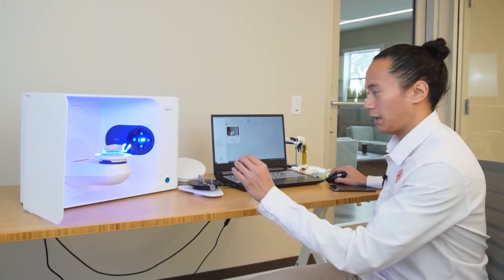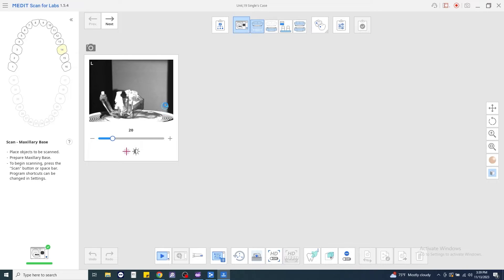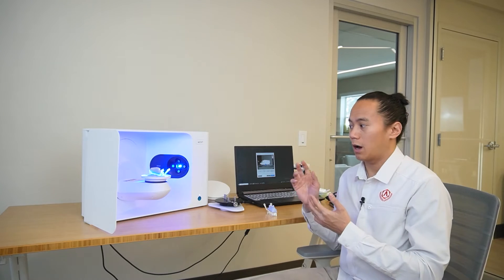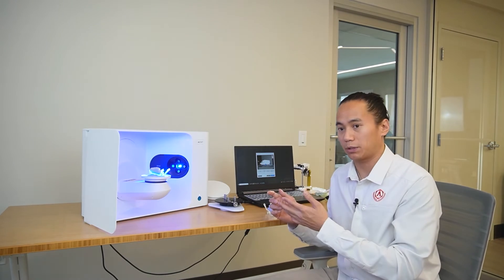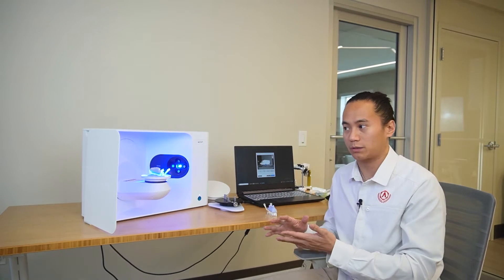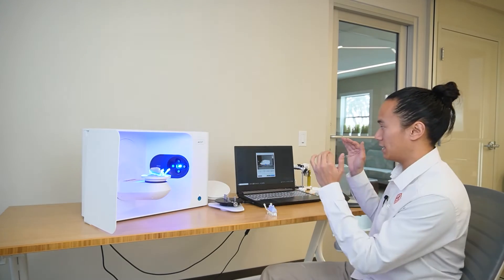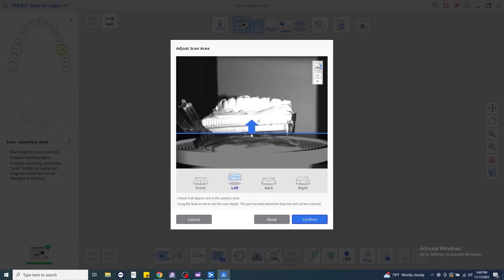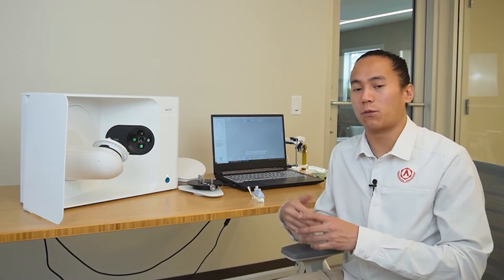Double check and confirm the brightness with Auto Brightness. And then click Scan. Now the orientation of your models onto the scan plate is not as important as making sure that the scan stage is at the correct level. So from here, we're just going to confirm the level that we want the scanner to pick up. It does help the software align your scans if you keep the orientation consistent.